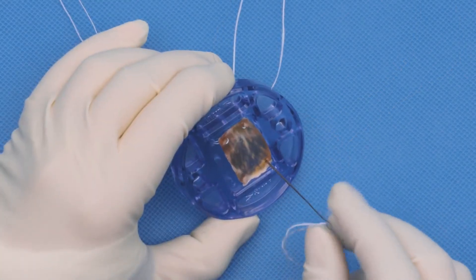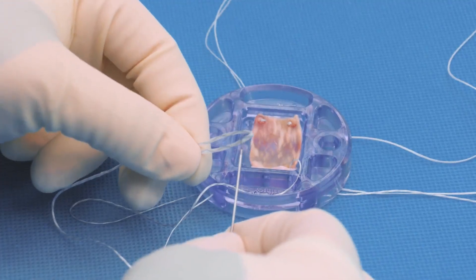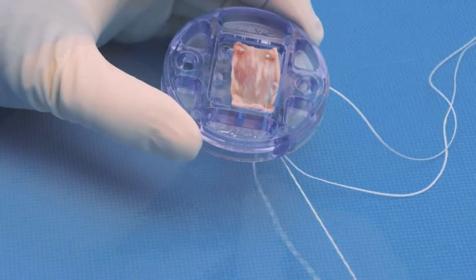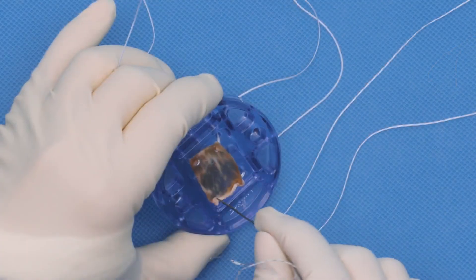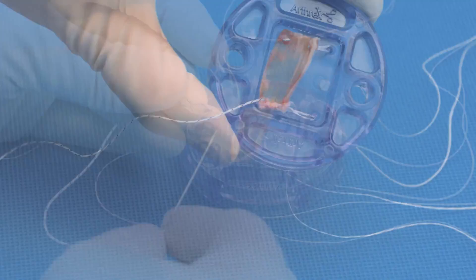Using the same keith needle, the fiber link suture tape is passed through the corner of the graft in a mattress configuration. Repeat on the opposite corner with a tiger link suture tape.